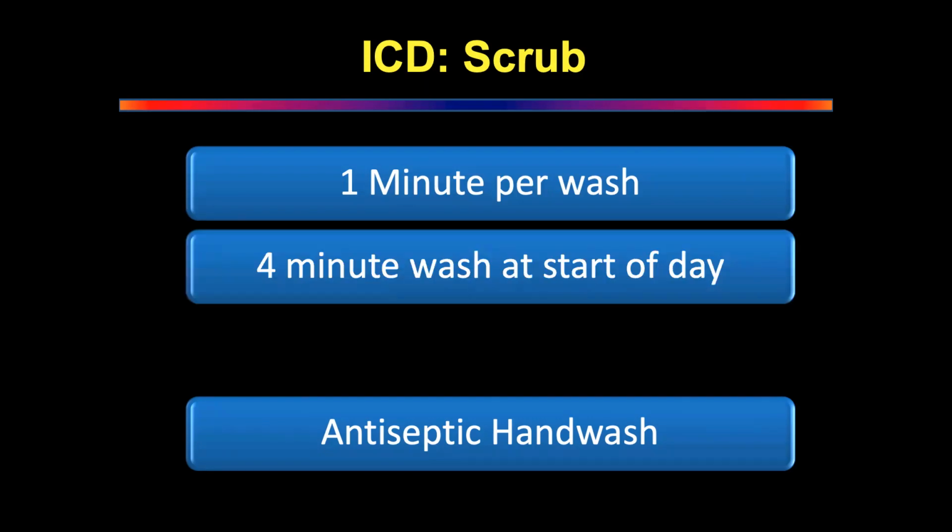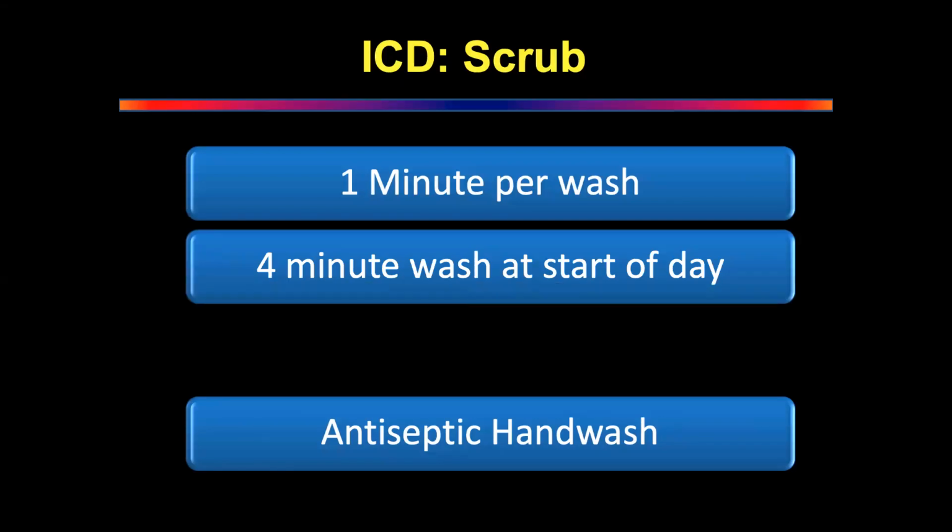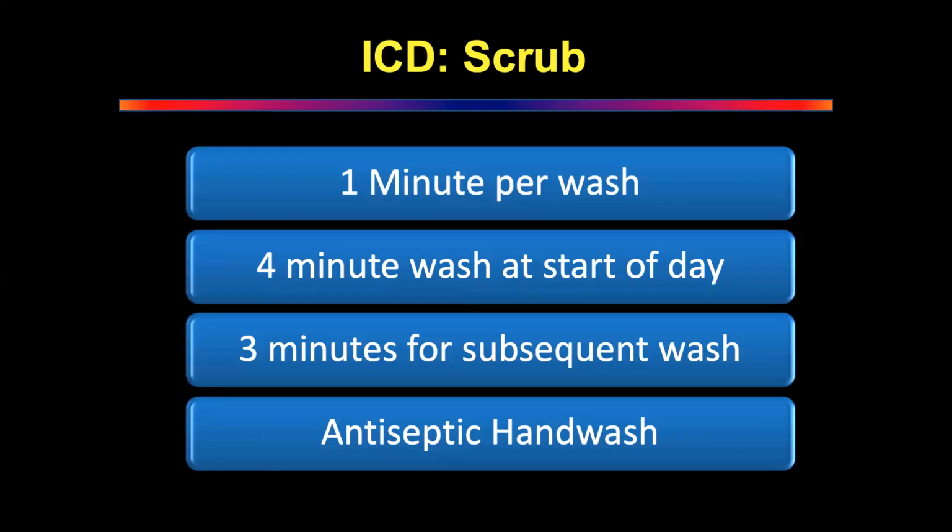No, we're still at scrub. We're still at scrubbing. What is your first wash? 4 minutes at the start of the day. Yes, sir. 3 minutes for subsequent washes. Yes, sir. Okay, so it has to be 1 minute per wash, then you take the liquid again, 3 times.